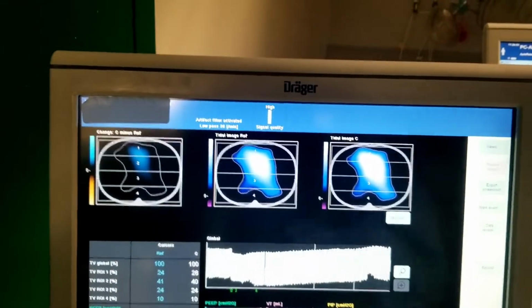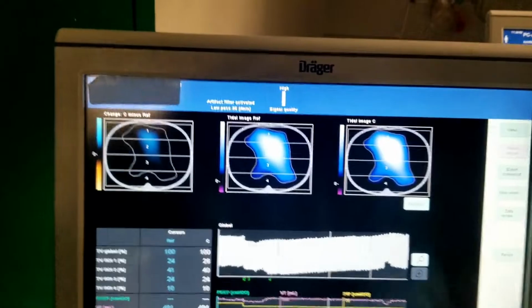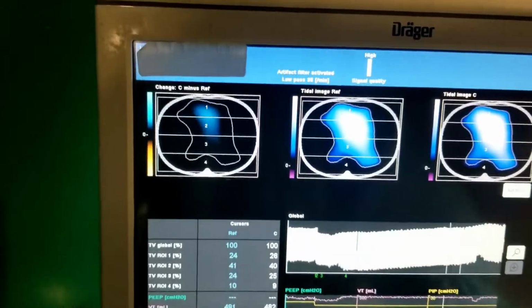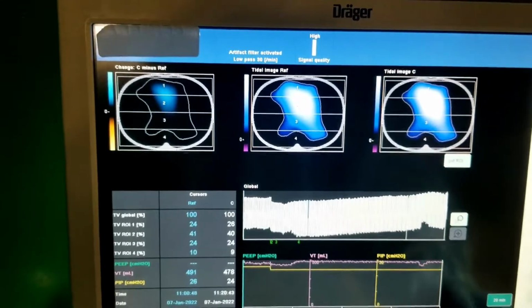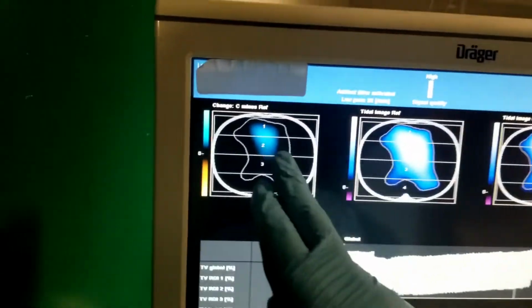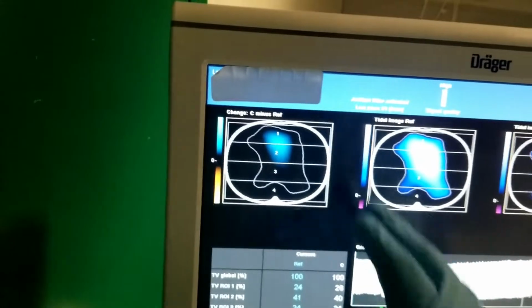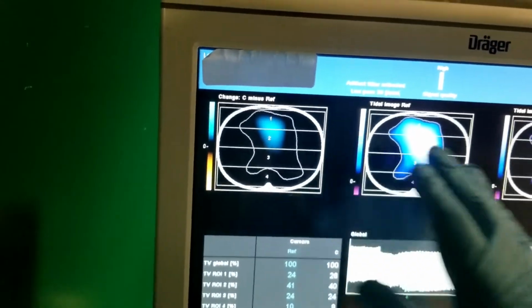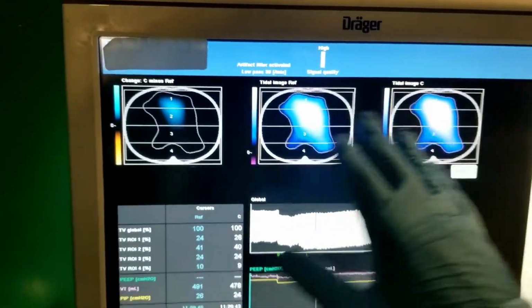You know that you're probably slightly too high and you're in the non-compliant region. This is in a way a representation of that. All right, and we just bring it to the end. Okay, so I know right away with the color that from 26 to 24, I did not lose any of the inflation distribution here.